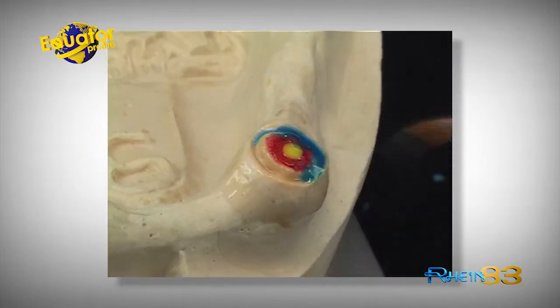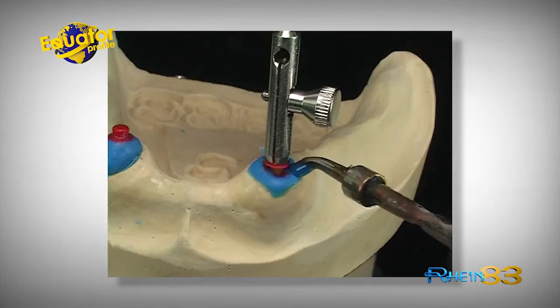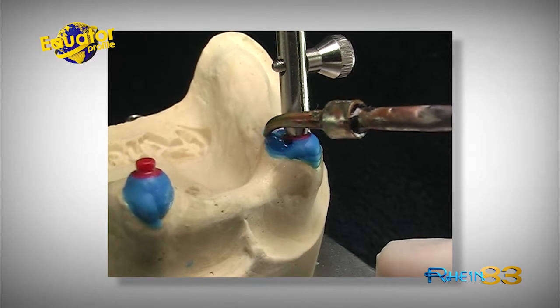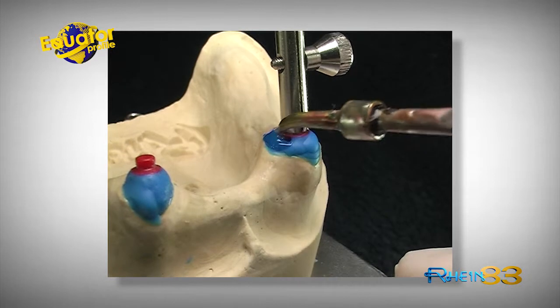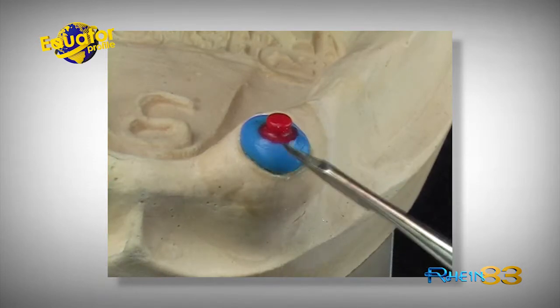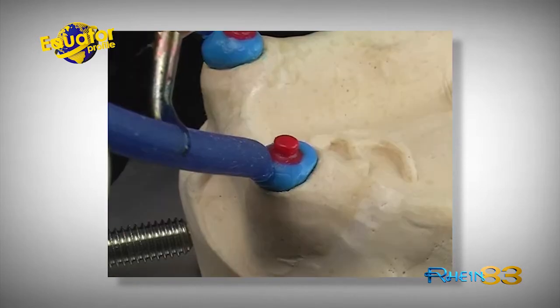Wax up the root caps and connect the two elements with a drop of cyanoacrylate. The position of the attachment will be set up by using a silicone vestibular mask, and the direction has to be related to the occlusal plane. The wax must be thick enough to allow a perfect finish to the cast cap, using gentle instruments like polishing brushes and rubbers.